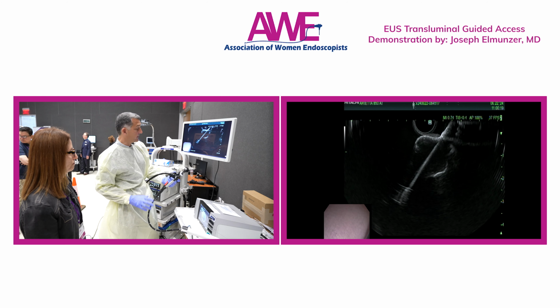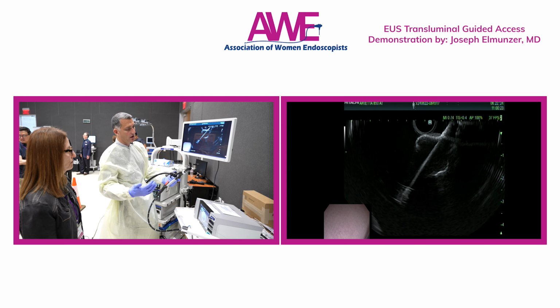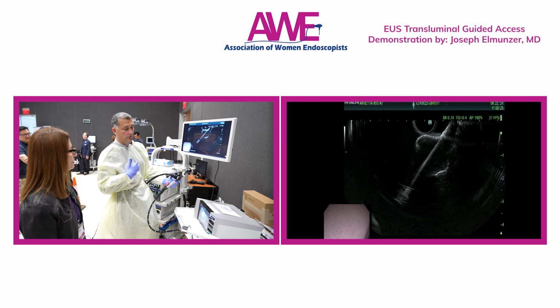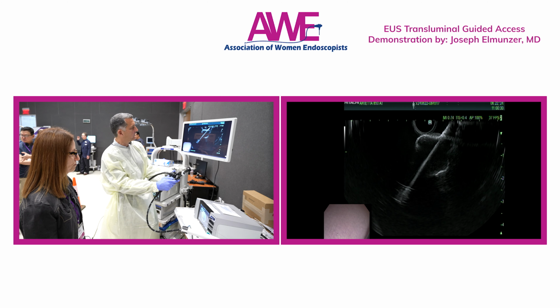And once we've done that, then we're really happy. We know we're in the target structure. And then the question becomes the next step: how to ensure that we deploy the proximal flange on the luminal side. In my experience, the best way of doing this is unlocking the catheter hub and then pulling back on the stent.